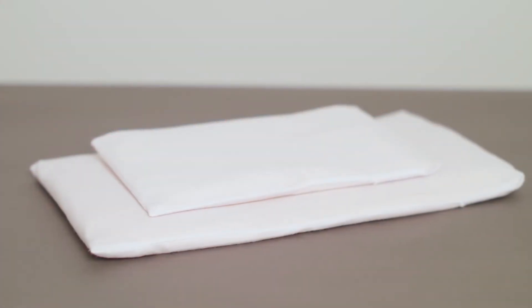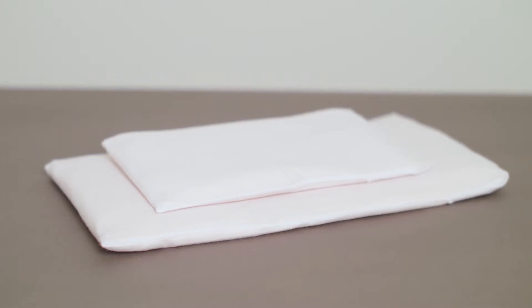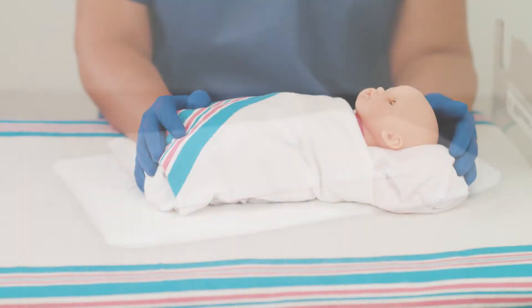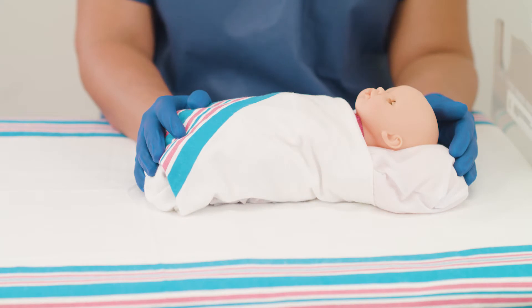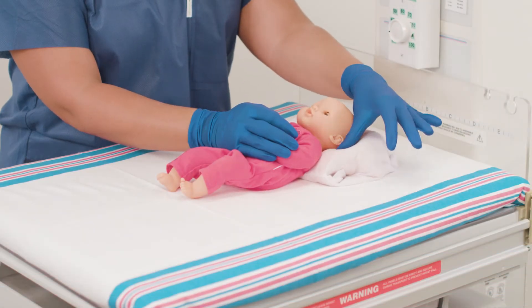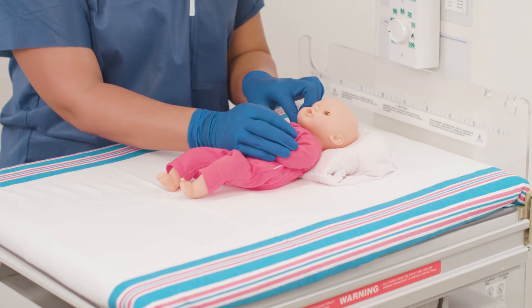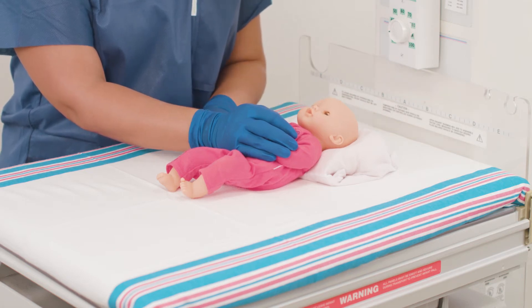The small positioner comes in multiple sizes and an appropriate size should be chosen to support each patient individually. The fluidized positioner can be molded around the baby's head and retains that position to help achieve skull symmetry and avoid cranial deformities. There is more than one way to mold the positioner for head positioning. In this video we are showing two ways to achieve head positioning and occipital offloading. The same techniques can be used to support head positioning in a side-lying position.